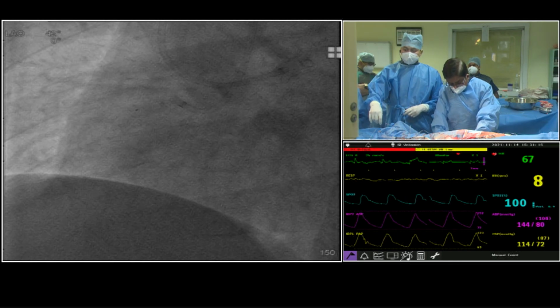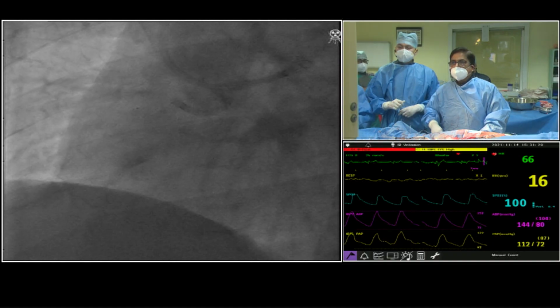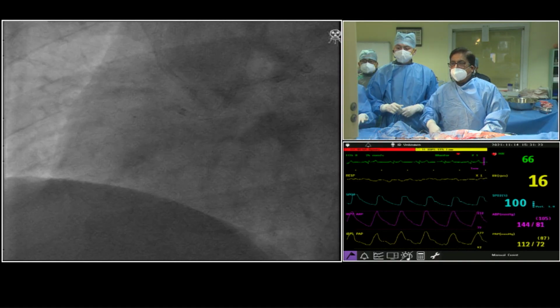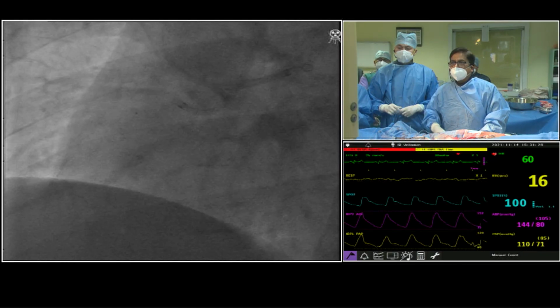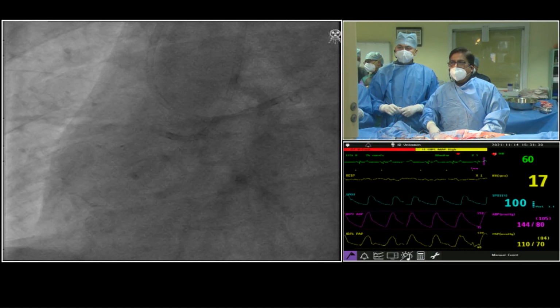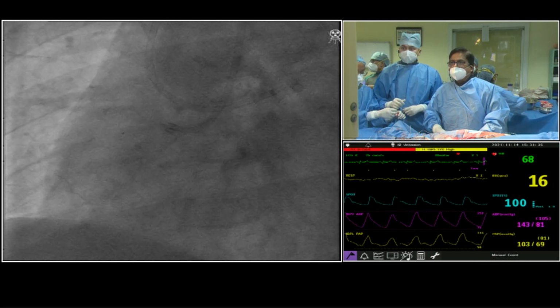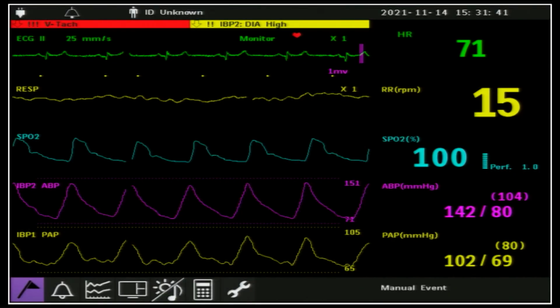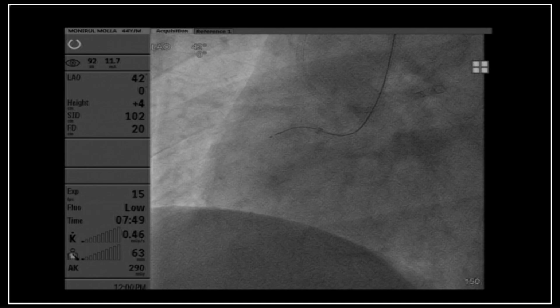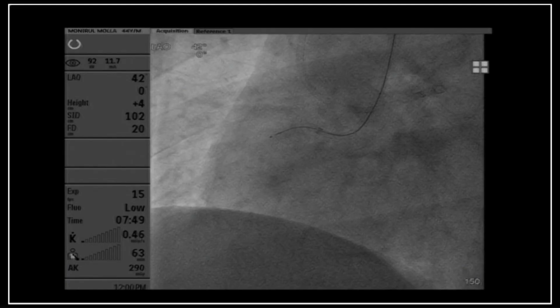Dilip, is there something that we could do about the screen? We have 3 screens there. I think most of us cannot see the full screen of the angiogram. If you can get rid of the hemodynamic and keep the angiogram film as a bigger screen. Wire. Let the wire come. There it comes. Get the hemodynamic made here. Really tight, okay, that's fine.